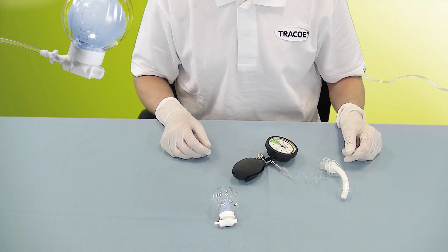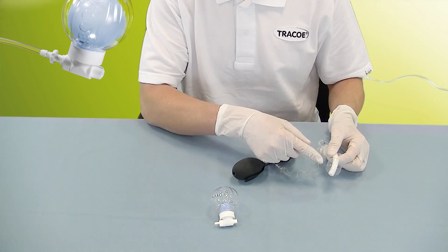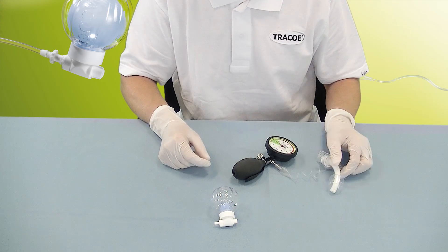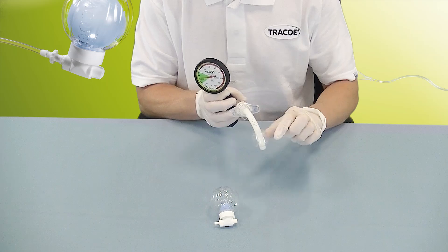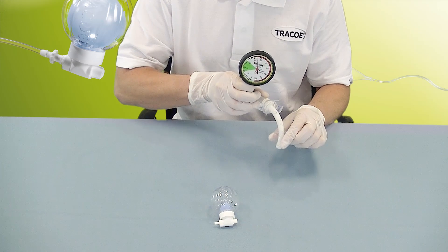Reasons for this are the following. The natural expansion of the cuff's material after inflating decreases the cuff pressure over time. The positioning of the patient from the sitting into the lying position on the side raises the cuff pressure.